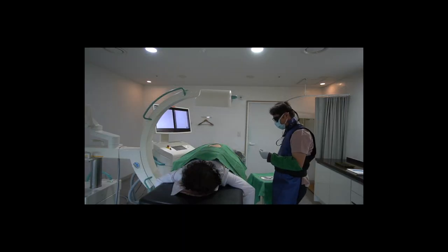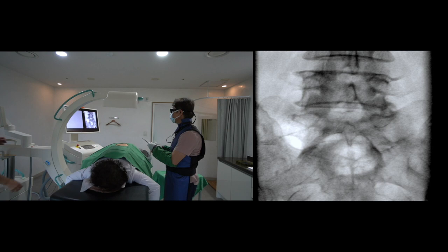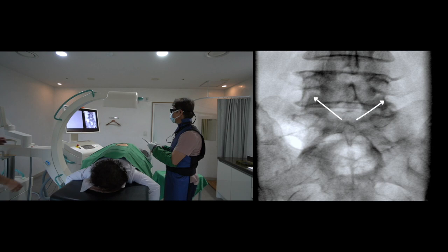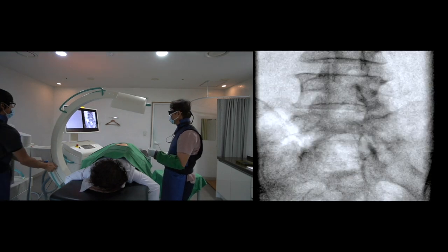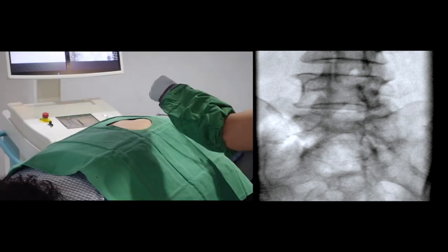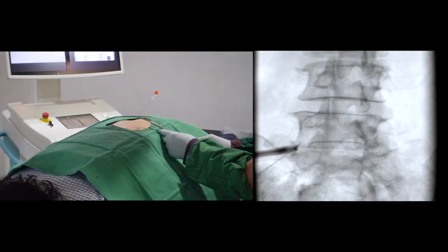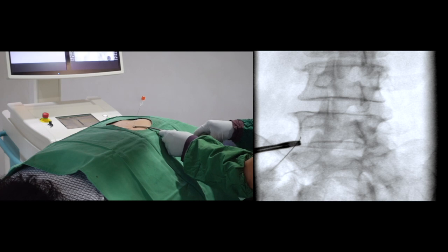I'll demonstrate the second case. It is a little more challenging — the prominent spurs of the superior articular process will be an obstacle on both sides. Let me rotate the C-arm laterally. I may have to move more to visualize the safe triangle.